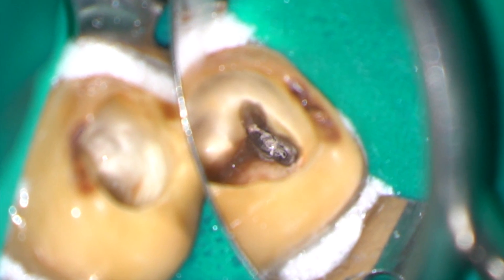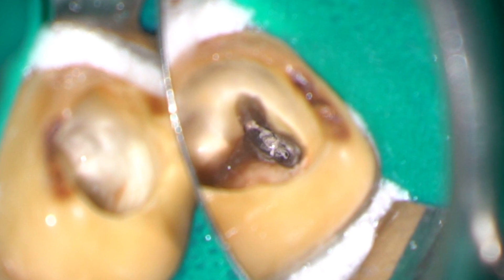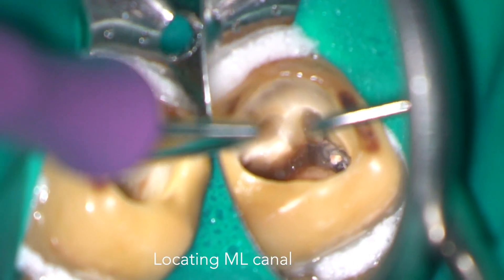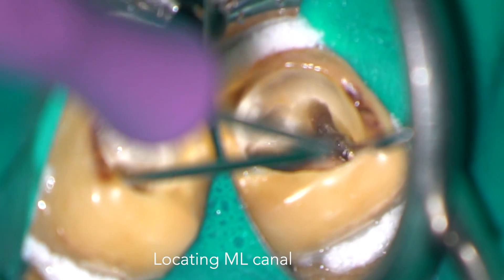I have removed most of the gutta-percha and bioceramic sealer from the MB canal and now it's time to hunt for the unprepared orifice of the ML canal. In this case I'm using a micro opener.